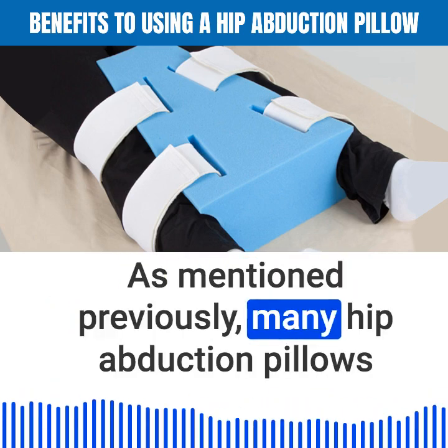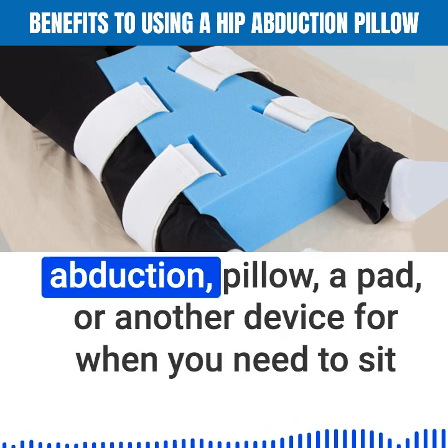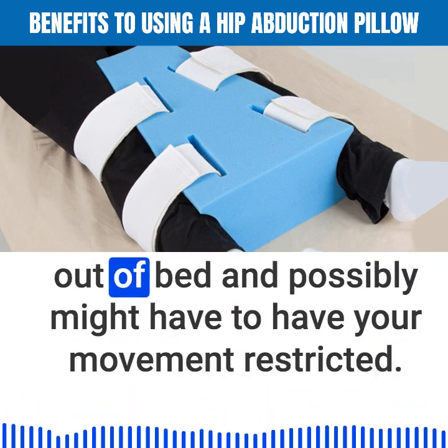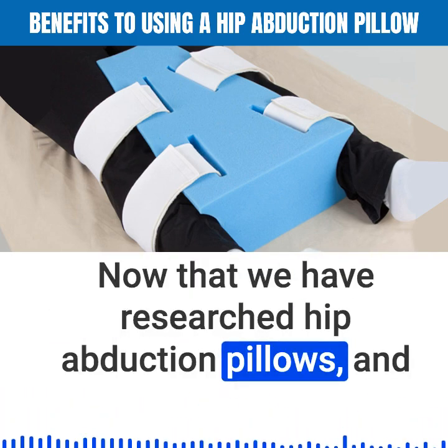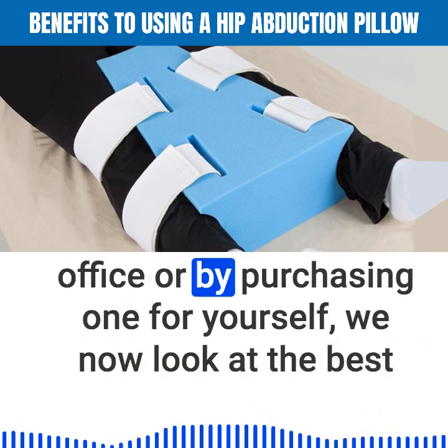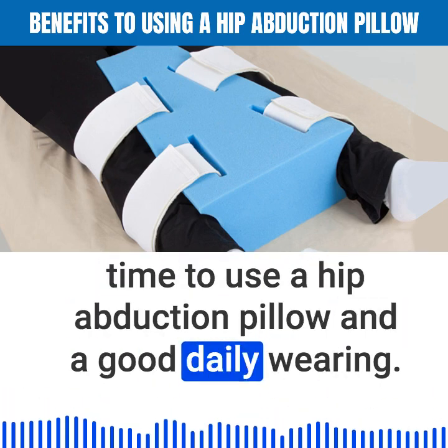Many hip abduction pillows come with straps to prevent slipping. Talk to your physician about whether or not you will require a hip abduction pillow, a pad, or another device for when you need to sit out of bed and possibly have your movement restricted. Now that you have researched hip abduction pillows and perhaps secured one through your physician's office or by purchasing one yourself, let's look at the best time to use a hip abduction pillow and a good daily wearing schedule.